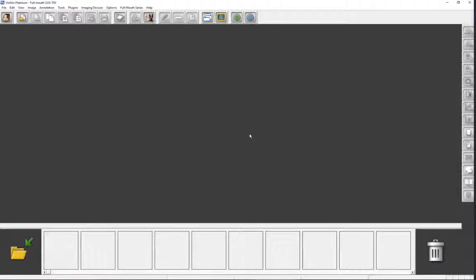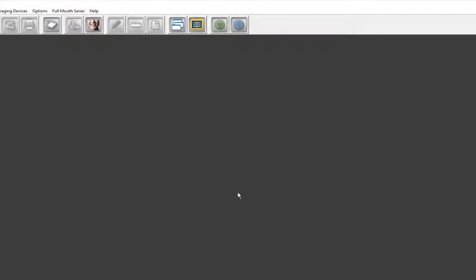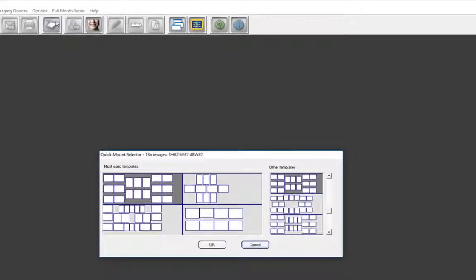A Windows layout view may be used instead, which will allow the user to display several images simultaneously on the Vixwin work area for comparison purposes. This option will be discussed in a separate video. To begin, let's mouse click on the Full Mouth Series menu bar icon and select New Mount.